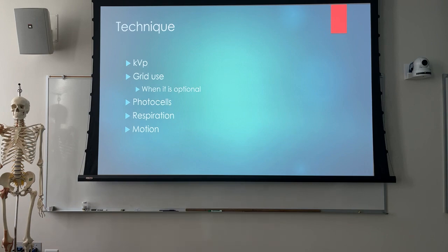Let's say you find yourself in a hospital that doesn't have a virtual grid. You're doing a portable. You're up on the floor. They just dropped a feeding tube into the patient, and they want an x-ray right now. Are you going to shag it down to the department, grab a grid, come back up and shoot it? You're looking for something very specific, right? Specifically, what is the danger with a feeding tube? It's going in the lungs. Do you need a grid for lungs? No, you don't.